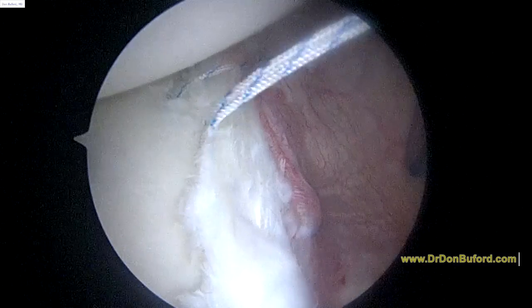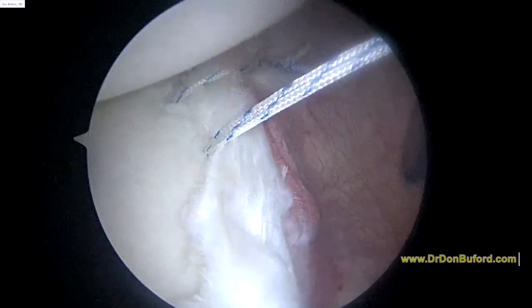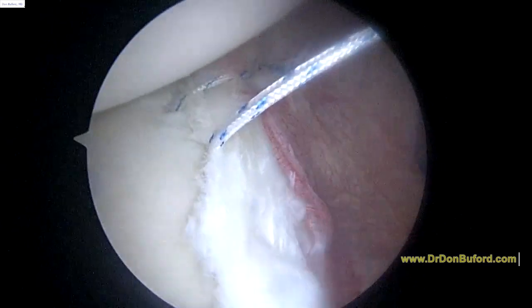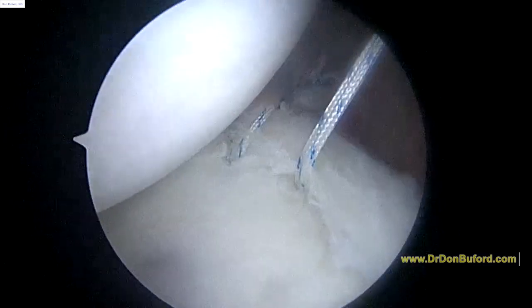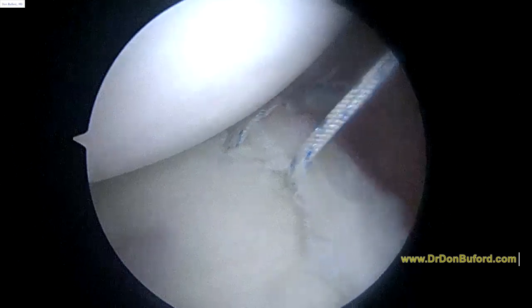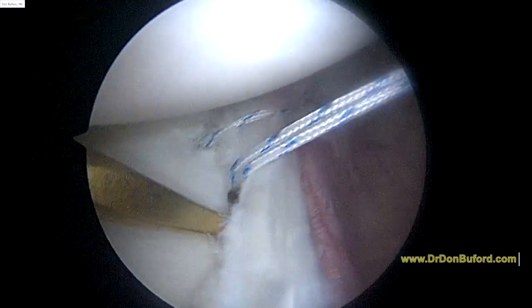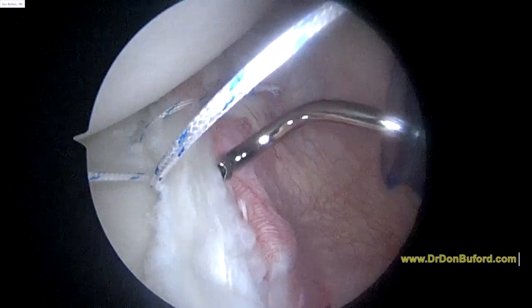With this type of anchor, we have to seat it by pulling back on the sutures. And that's what we're doing there. That looks very solid. So now we'll take a crochet hook and we will go ahead and do the same type of maneuvering that we did before, just to get the sutures one at a time. Okay, so here we are, going to make our second stitch.